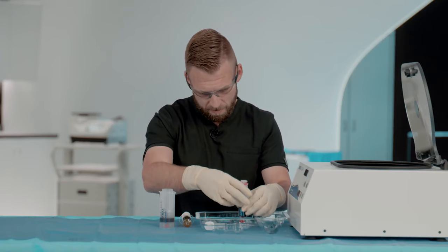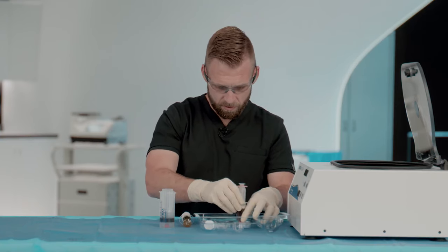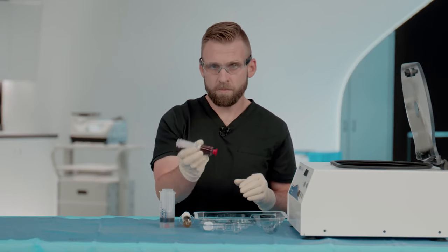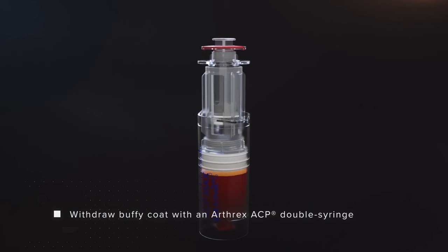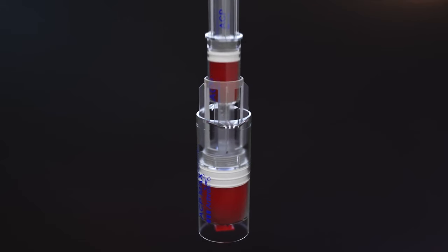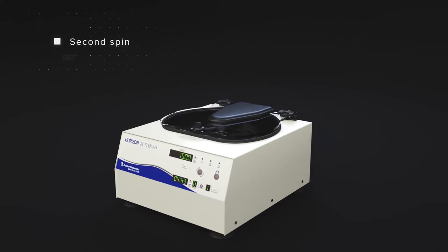The syringe will then be capped and gently inverted to mix the solution. Now, we'll spin for 1,500 RPMs for five minutes. This is consistent regardless of the initial blood draw volume. By stopping two tick marks short of the RBC layer, we ensure that we don't pull the buffy coat with the PPP draw. When we attach the ACP syringe, we draw the entire buffy coat layer, allowing us to re-suspend the platelets in this second spin.